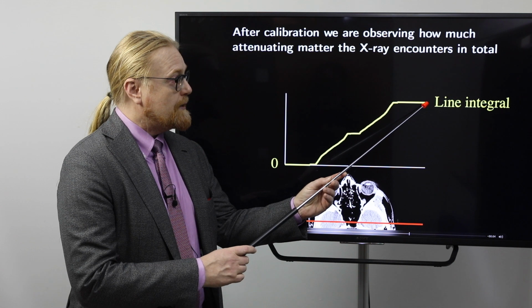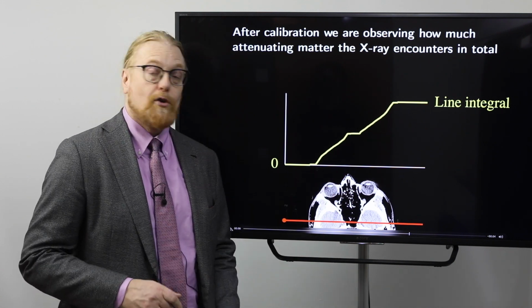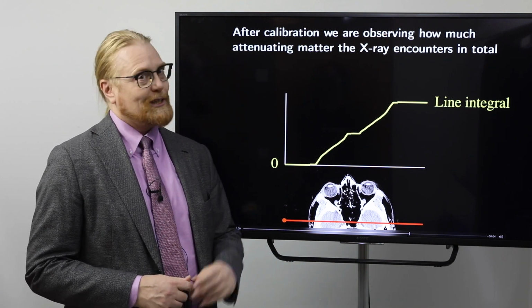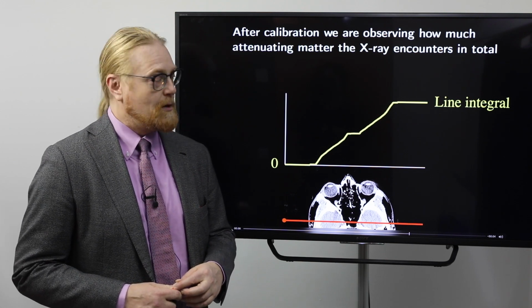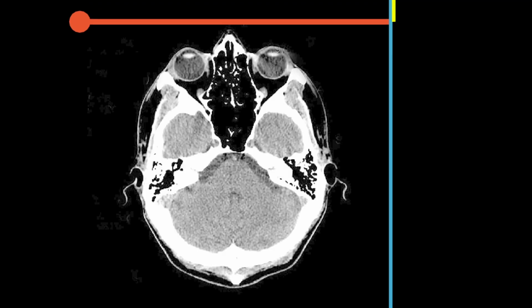So this amount is something we can calculate out of the X-ray image we took using the logarithm. So if you ever think, where does anyone need a logarithm? This is one answer. In medical imaging, it's crucial.